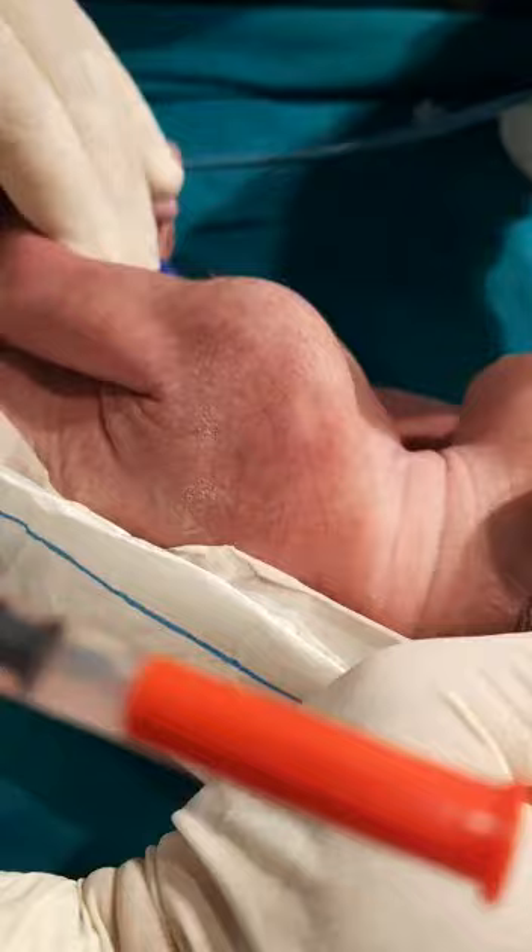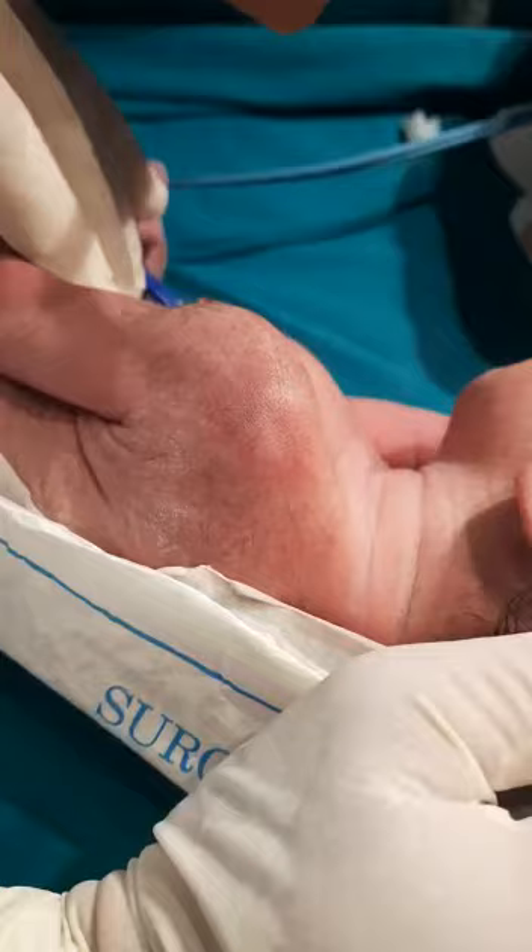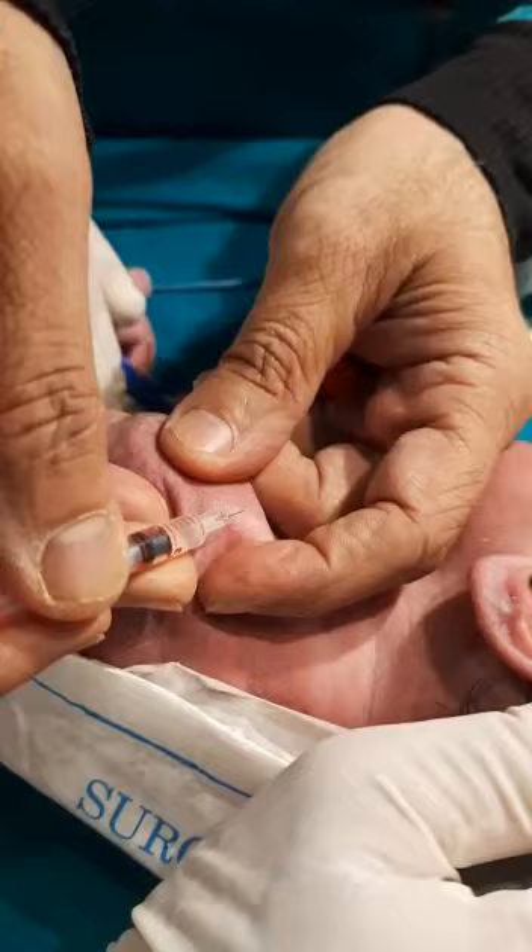I have cleaned this area with just a single swipe of spirit — you can do it with plain water as well. The bevel should be up. Spread the skin with both your fingers just below the tip of the acromion process.